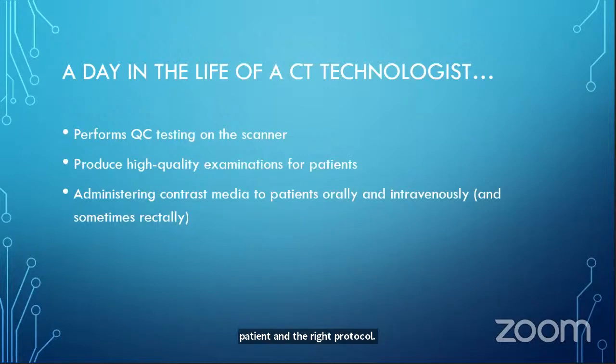All the protocols are set up in the scanner, but we also have to administer contrast to patients. And we do this orally, intravenously, and sometimes even rectally. So we give them oral contrast, and that lights up their intestines and their stomach. And then we also give intravenous contrast, which lights up all the vessels, and also, as we just saw, hemangiomas and other things that are going on inside the body.